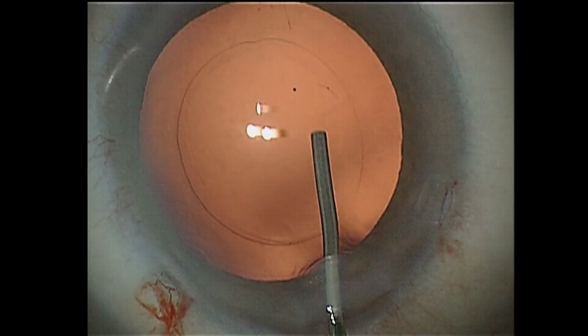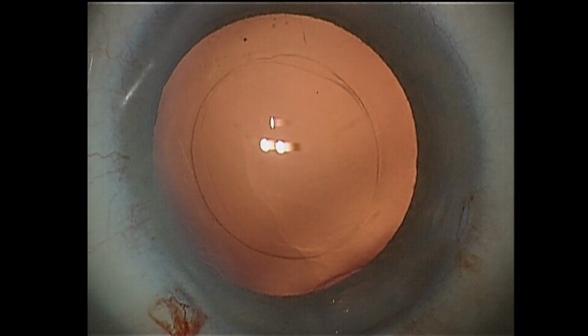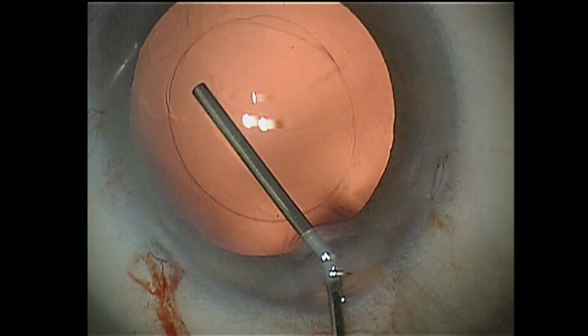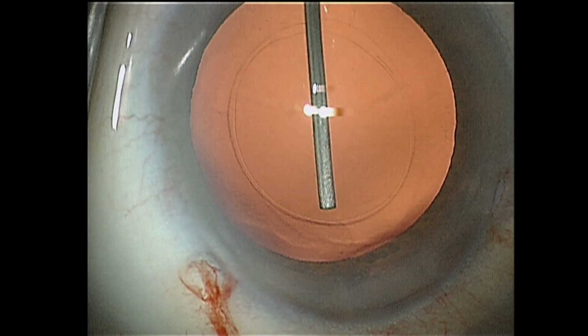Using a blunt cannula, Healon is injected beneath the posterior capsulorhexis edge in order to circumferentially visco-dissect the anterior hyaloid from the peripheral posterior capsule. The advancing dissection line can thereby be easily visualized.